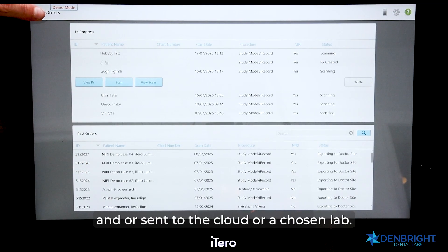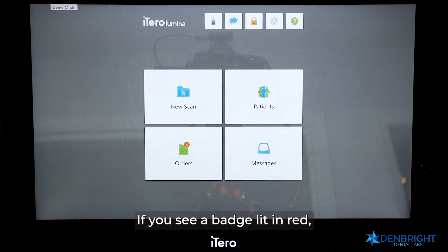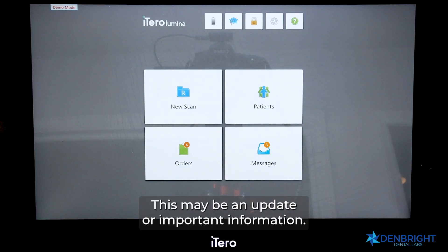My final box is Messages. If you see a badge lit in red, this is notifying you of a message from Align Technology — this may be an update or important information.